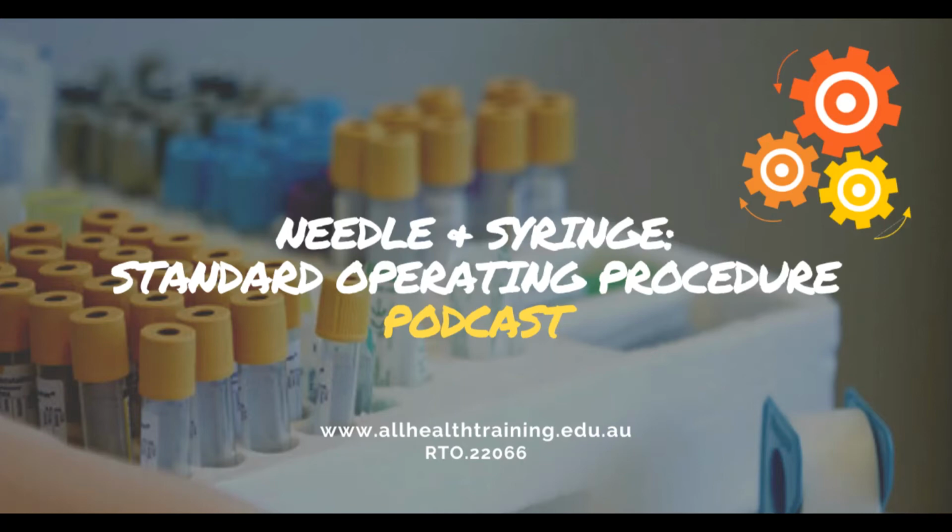We now need to assemble our equipment. Prepare our tubes by loosening the lids to make it easier to take off later. Open the syringe packet slightly and purge the plunger while still in the packaging. Remove the white lid of the packaging so that the syringe is resting in the clear packaging. Open the needle, ensuring we do not touch the hub. This is the part that connects to the syringe, so we don't want to contaminate that.